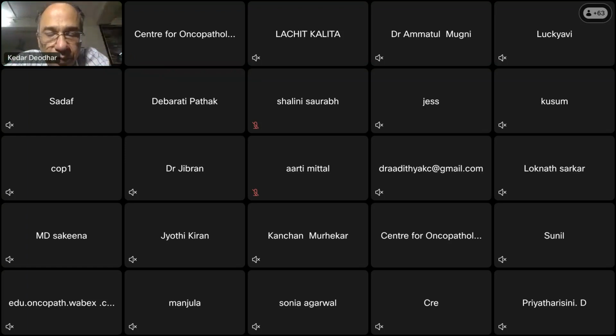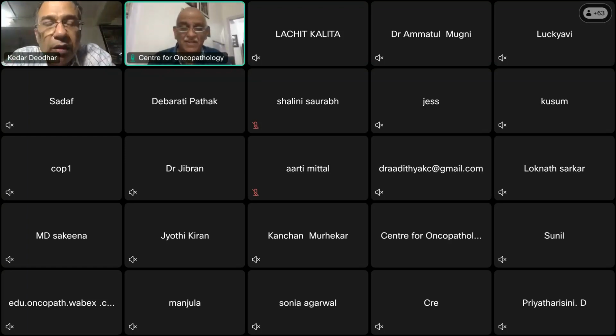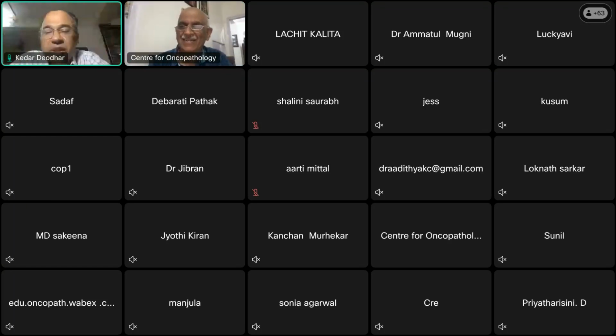Okay, sir. Kedar, great presentation, and so many questions are coming up. There are a lot of compliments for you. No, thank you. I think it's very practical, and I must confess there are again gray areas. It's not that we have all the answers, but I think the questions were spot on. This is what we learn from our multidisciplinary team aspects. These are some of the clues we get from medical oncology about how they treat, and that gives us what to write in our report.